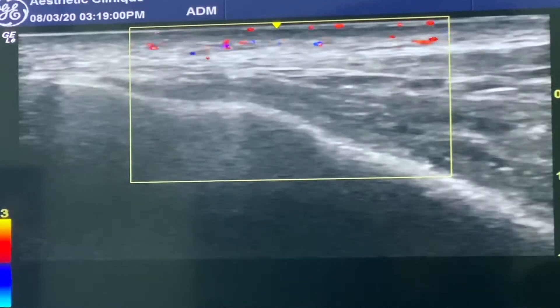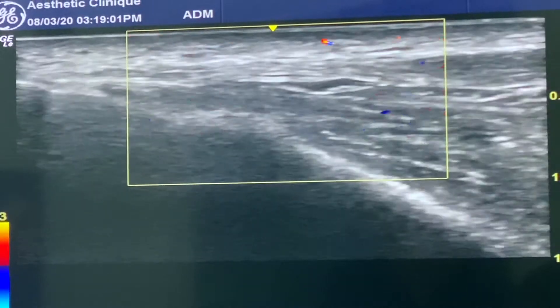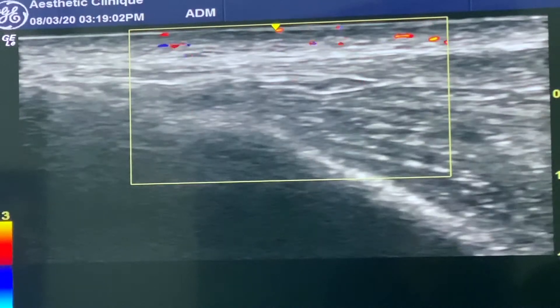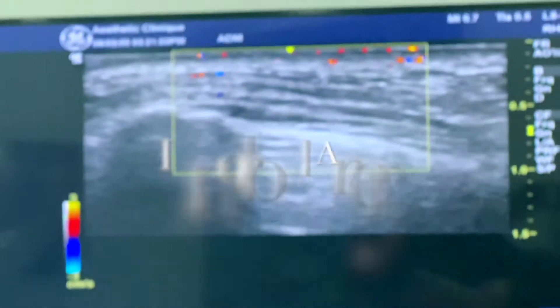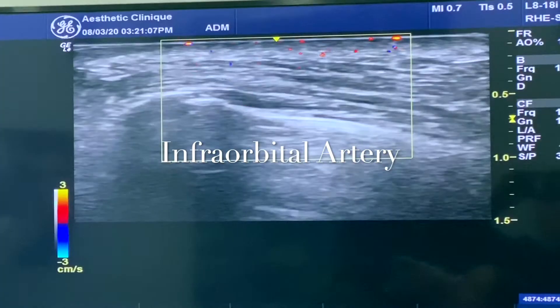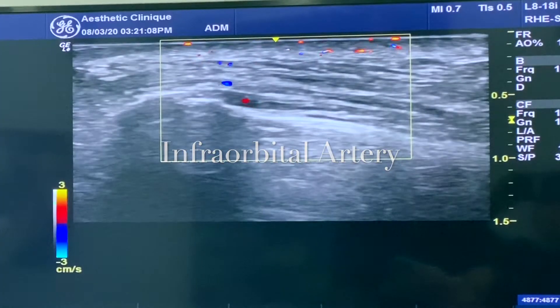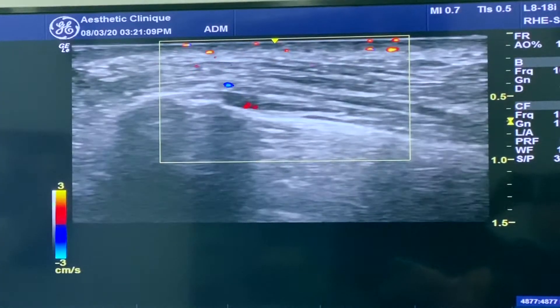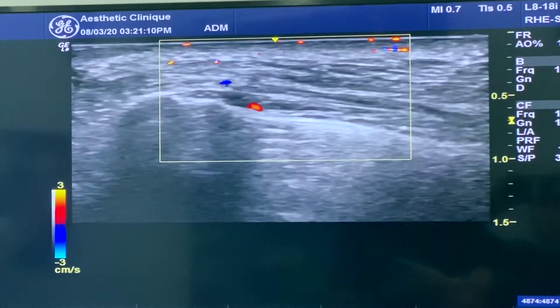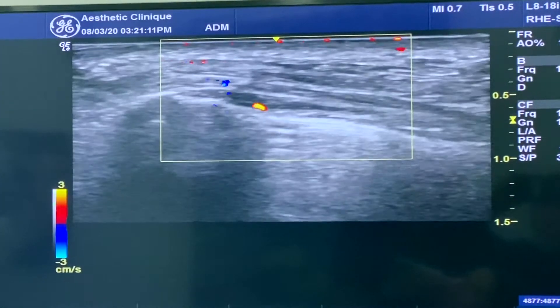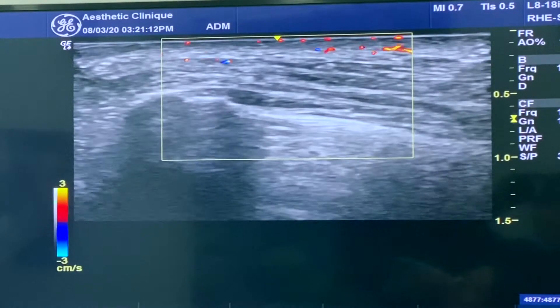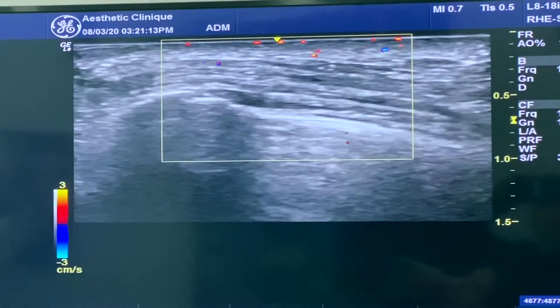That's the anterior deep temporal artery. So what we're looking at now is the infraorbital artery. It measures about seven millimeters deep, coming out of the infraorbital foramen.